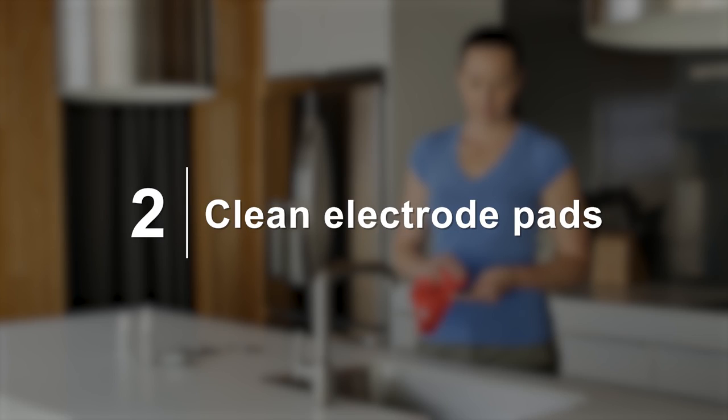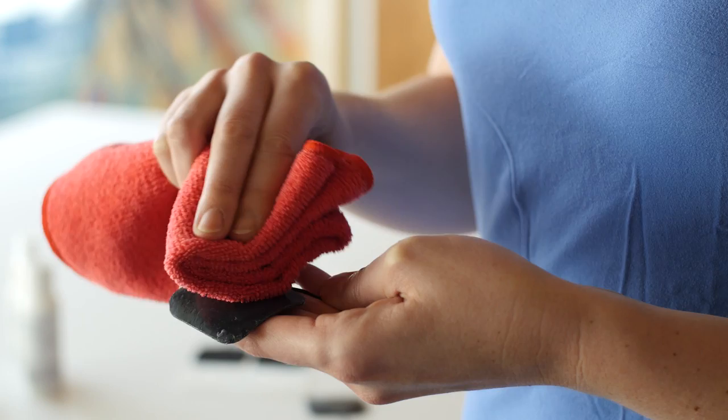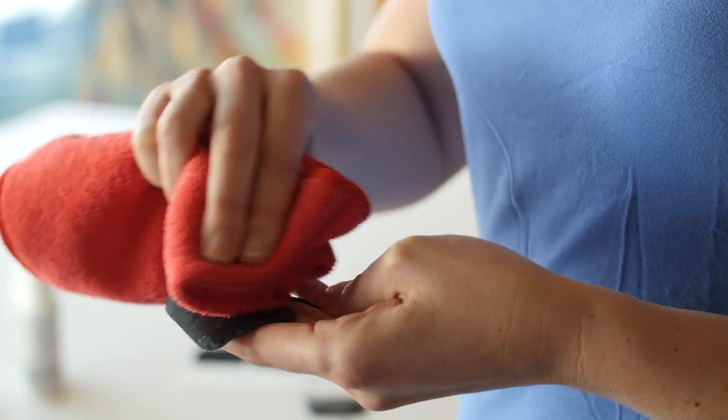Two: clean electrode pads. After each use, clean your TENS electrodes with a moist cloth.